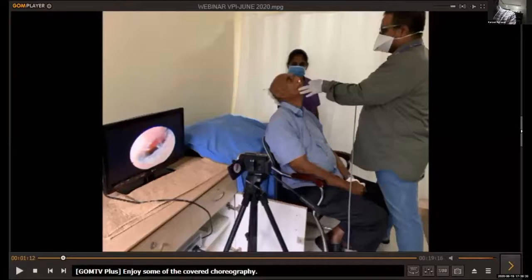I can show you this. If you give me a minute, I can share my screen. Yes, you see, this is the monitor and the console. It does contain the software, but we have stopped using it because it's poor quality. But you can always innovate. In India, we say Jugaad. So we put a camera here. With this camera you need another person to record, because with the software, the speech pathologist can record both the audio and video directly onto the computer. But if you want to record here, somebody else has to do it, and you have to copy it onto the computer. But it can be done. You have seen the quality when I projected, and it gives a decent recording of both the audio as well as video.